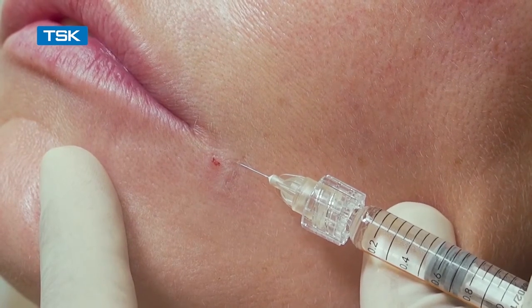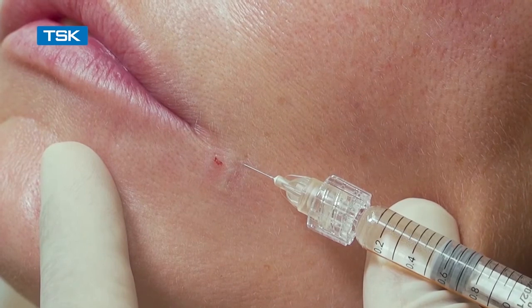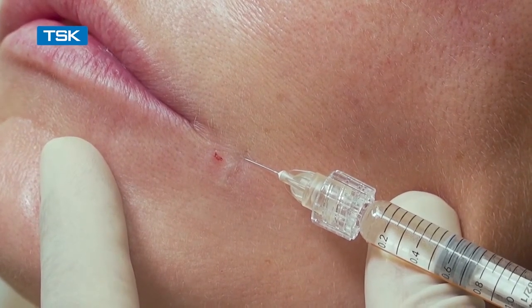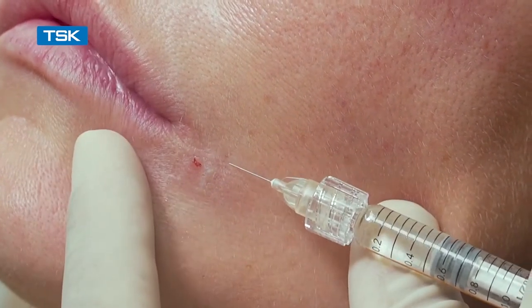The needle glides into the tissue, into the intradermal space, and then is withdrawn in a sliding movement to cause minimal bleeding as the injection is performed.